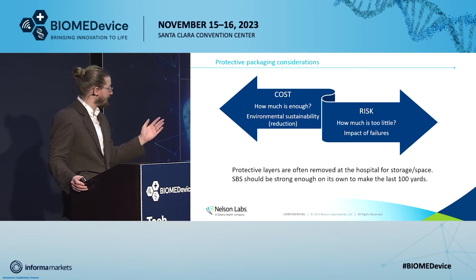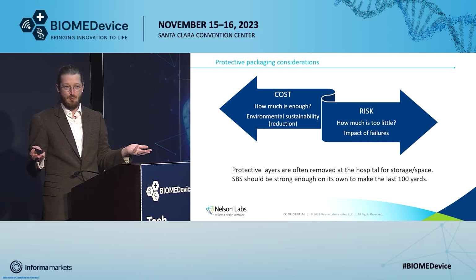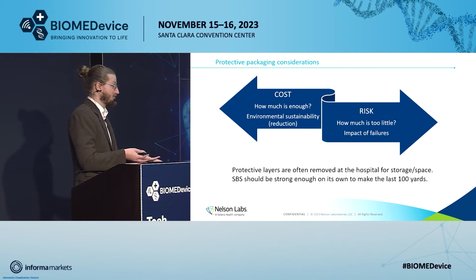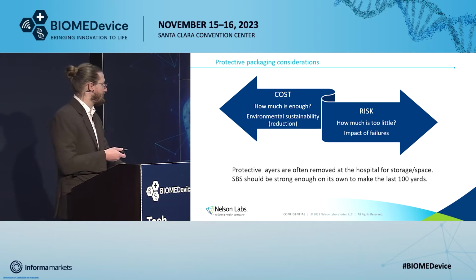On the flip side, it gets really risky. You have to take into account what I mentioned at the beginning, which is how much is too much, how little is too little. You've got to maintain your sterile barrier system. It has to survive the trip, and you can't go overboard.